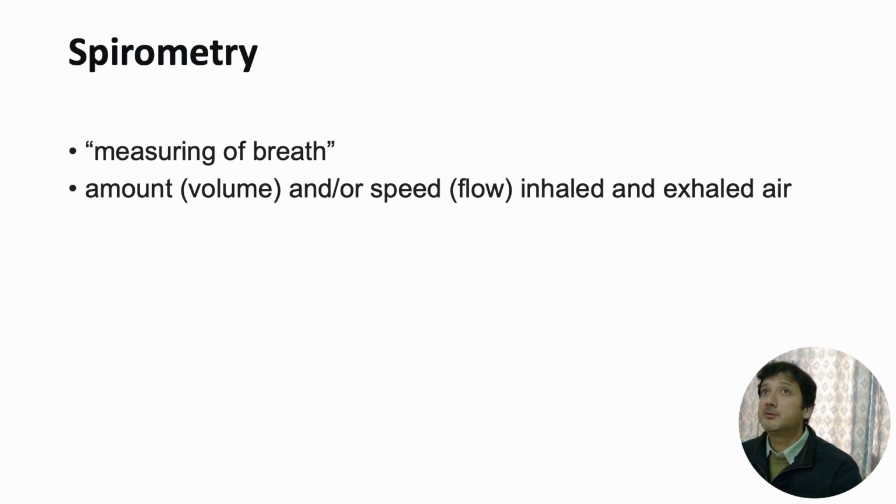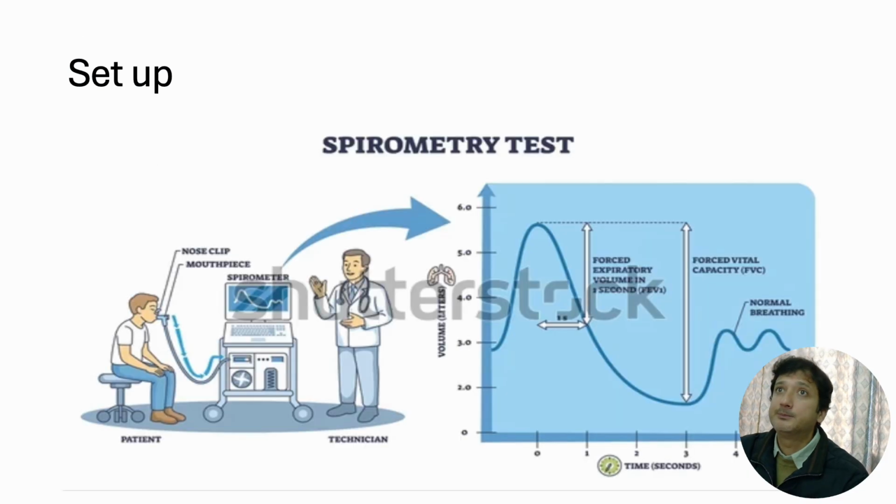What is spirometry? Its literal meaning is measuring of the breath. Here we measure the amount or volume and the speed or the flow of the inhale and exhale.